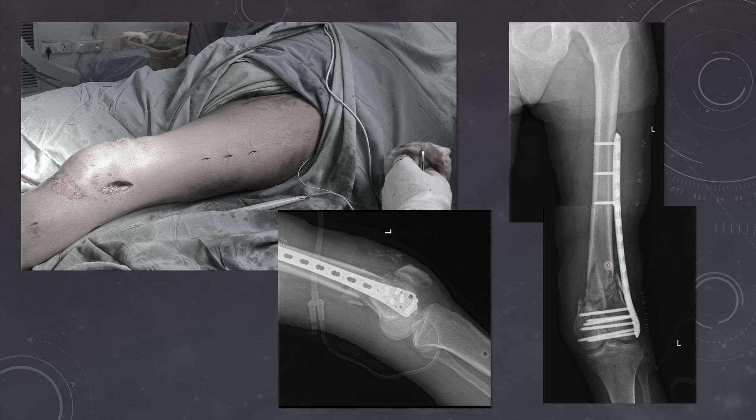This is the kind of assembly we get after placement of the locking screws in the diaphysis. We have placed 3 locking screws in this part — 4 could have been used if the bone quality would have been doubtful, but here the bone quality was good. The metaphyseal part which had comminution has not been disturbed — there are no screws in that zone. In the peri-articular part, we have spanned it with the maximum number of screws possible because we want absolute stability in this part, while in the comminuted part we don't want any screw because it has to heal by callus formation and relative stability. We close the iliotibial band layer first, followed by subcutaneous closure, then skin closure. Apply a compression bandage for the first 24 hours.